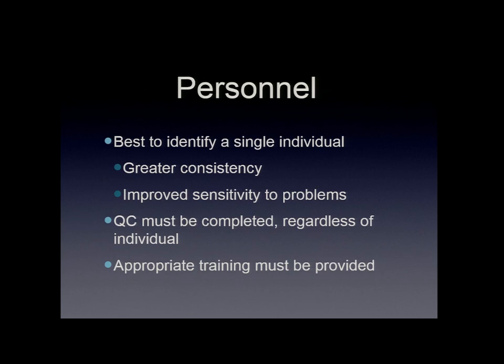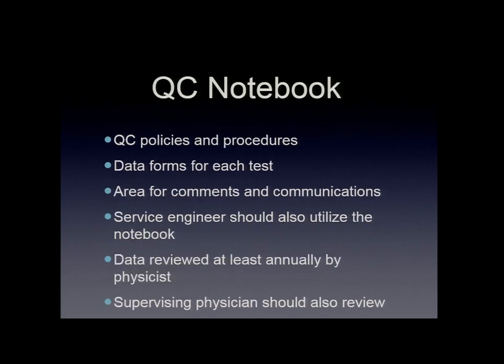Now, when we go there and they're new to QC, or if there's new people, we actually run the QC when we're there for the annual. We do it ourselves because we like to check to make sure it's really happening. And then we go through it with them, and we train QC people that haven't been used to doing it. We can actually award some credit hours for that as well. That helps to keep them around, because the big thing is when the physicist shows up, they all want to go, oh, I can go, right? It's like, no, I need you here, so I make sure I'm testing this, how you use it.